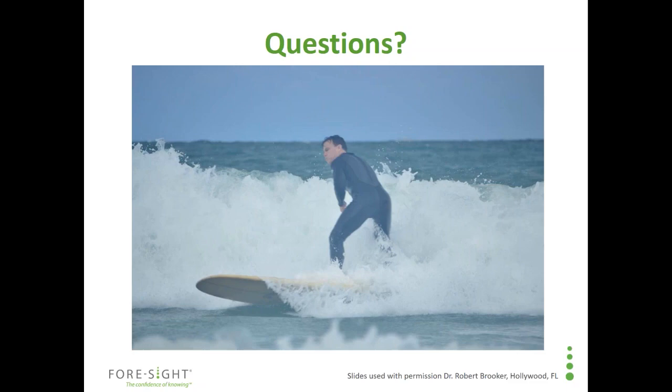So the way I would look at that is it's better to know that the surrounding brain is getting adequate oxygen delivery than not. And if the saturation is unilaterally dropping during the operation, that would prompt you to immediately get a CT at the end, and then that patient may need to have decompression or some type of neurologic surgery concurrent with the heart operation. So in either of those situations, the oximeter can provide helpful information about what's going on with the brain in the penumbral or the surrounding areas that could be useful to you.